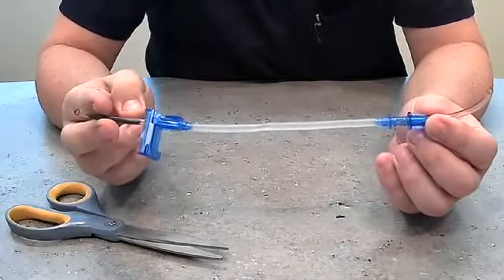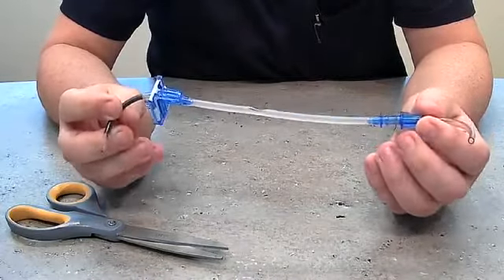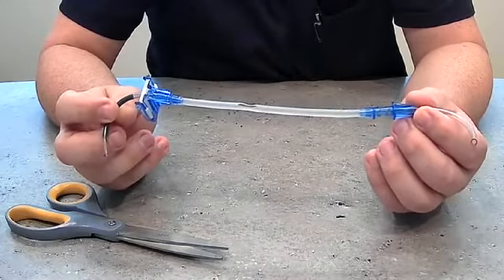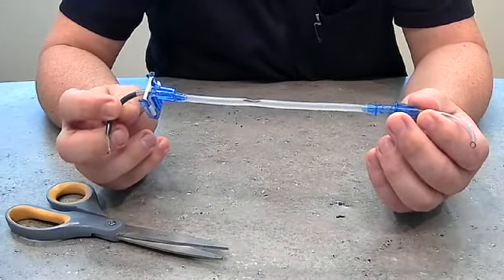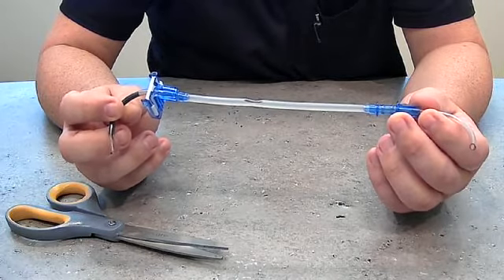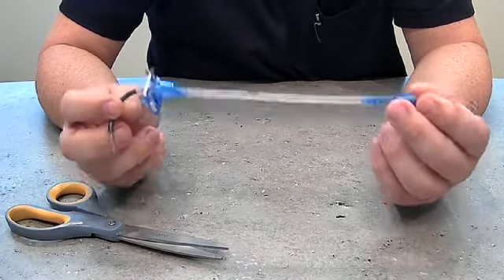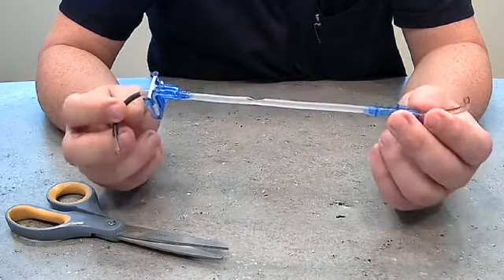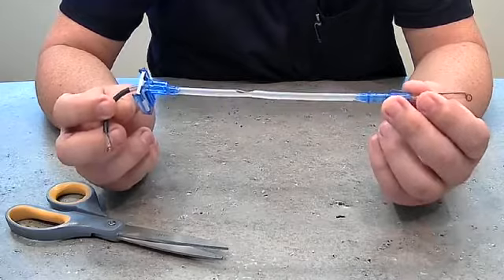This is a quick way for you to be able to save solution in your center and teach RNs, PCAs, LPNs, and everybody else how to use your Alaris pumps without actually wasting any product. You'll be able to put that money back right into the system. Thanks so much.